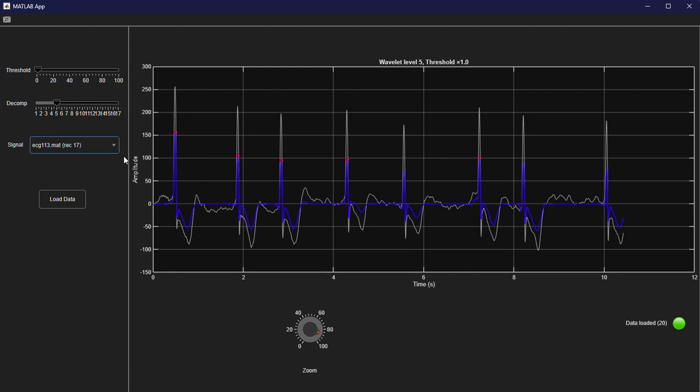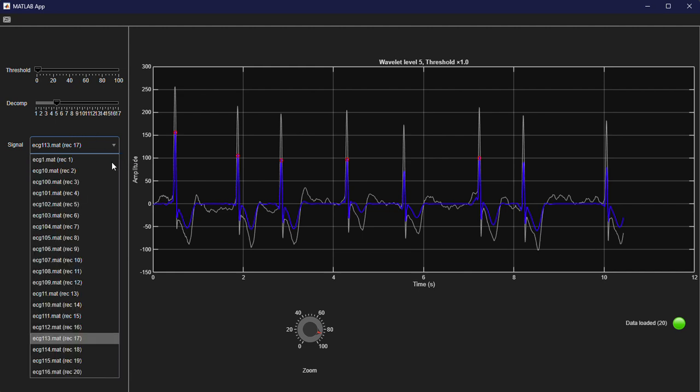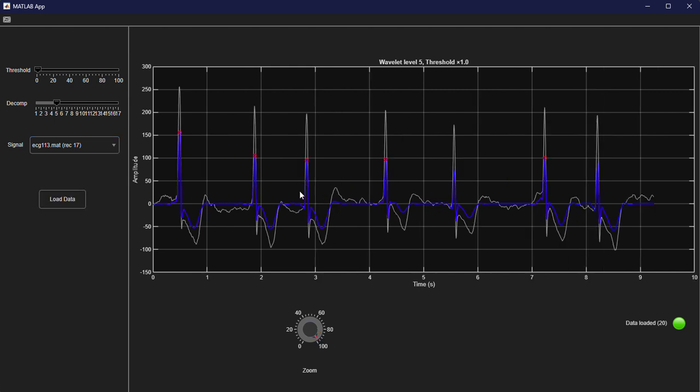So each time we select a signal here, we apply this process to this raw signal and plot the filtered signal over the top. And that is the functionality of the QRS Simple app.